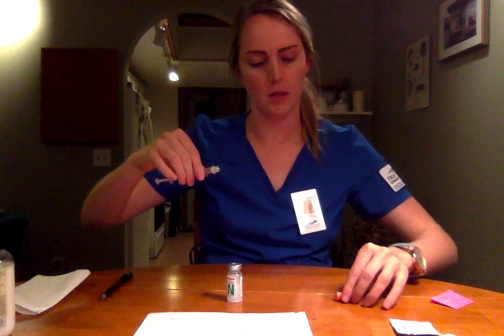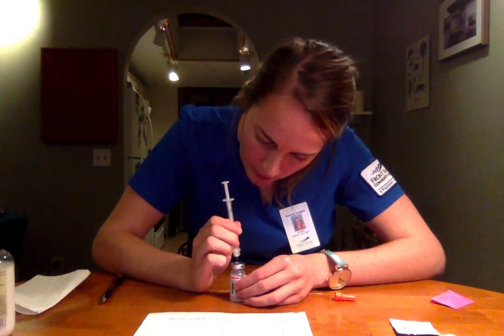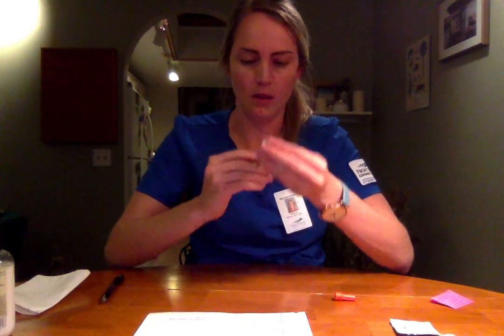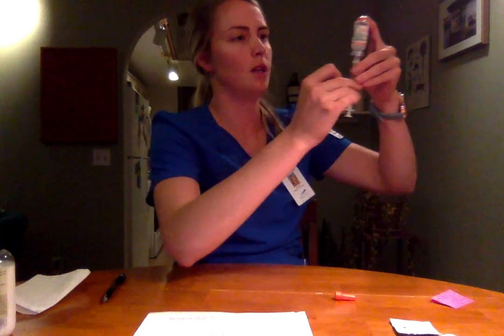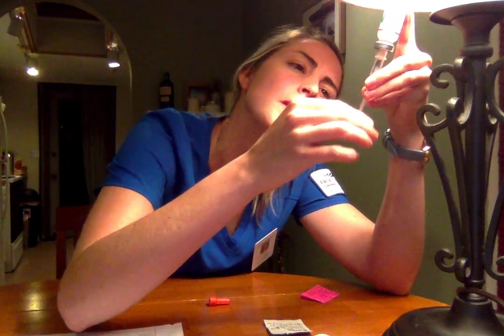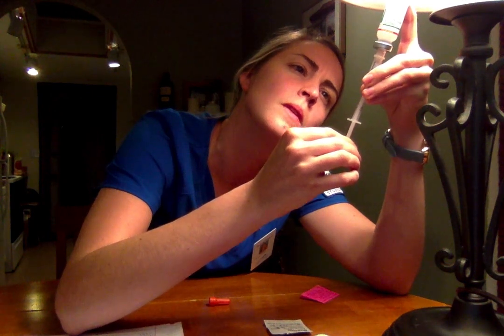Maintaining sterility, I'm going to place it on its side. Now I'm going to inject the air, so bullseye, inject, and turn it over. So making sure that I'm not drawing up any bubbles, I'm going to use my light so that it's easier for me to see. Now I'm going to push back.